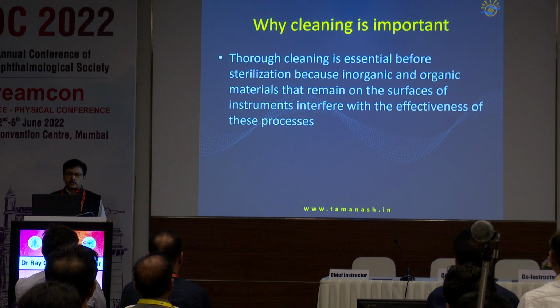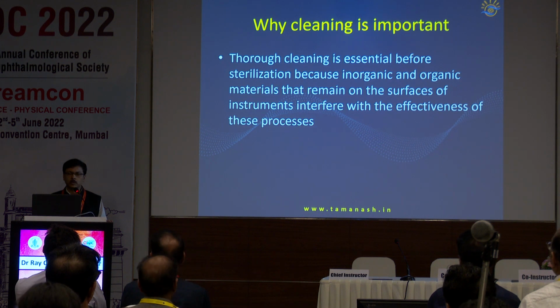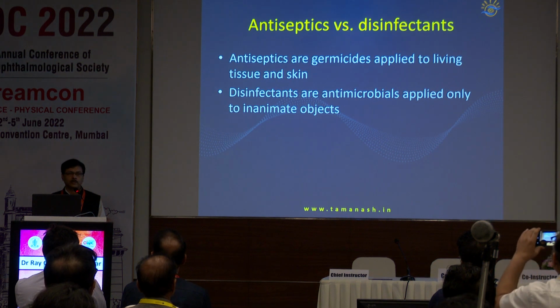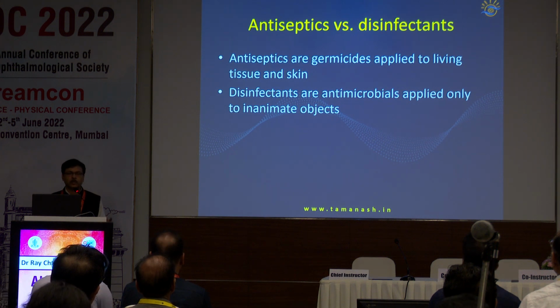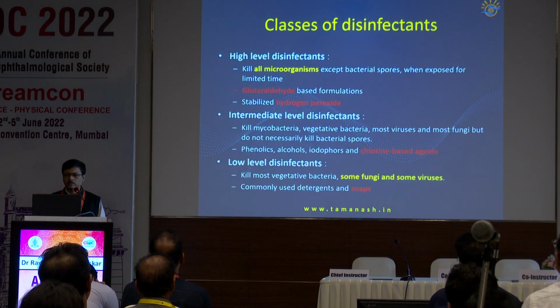So we have already dealt with this, why cleaning is important, because it interferes with the penetration of the sterilant, whichever you are using, whether steam or chemical. And antiseptics are germicides which are applied to the live skin. So the betadine dressing and draping that you are doing, that dressing is actually an antiseptic. So it is making your field free of microbes, whereas disinfectants are applied on inanimate objects. So OT cleaning will become a disinfection, cleaning of the surgical site will become an antisepsis.